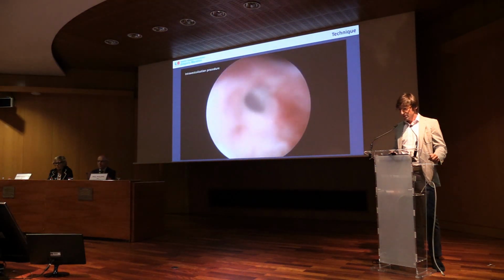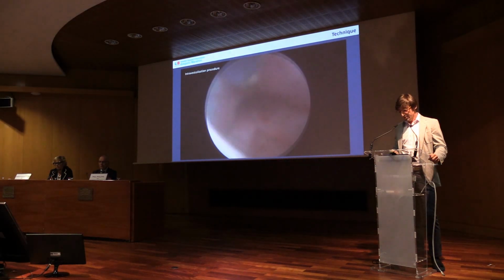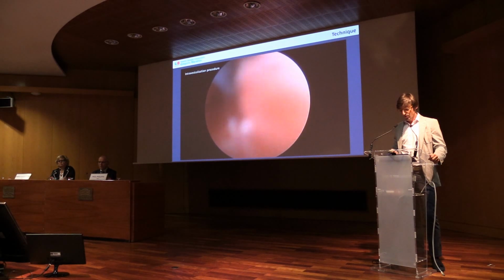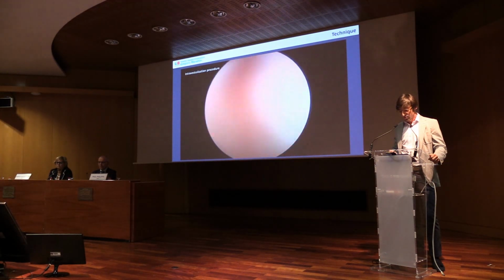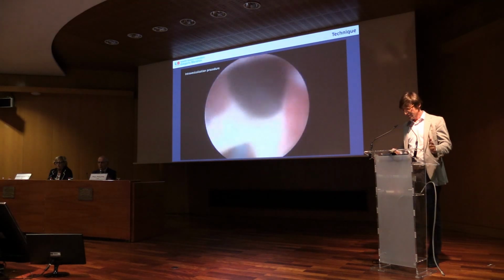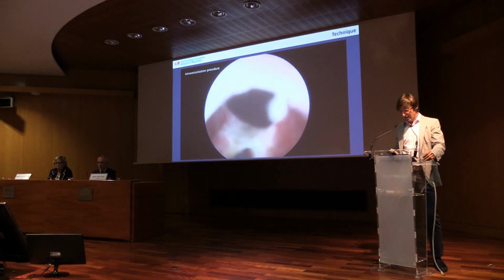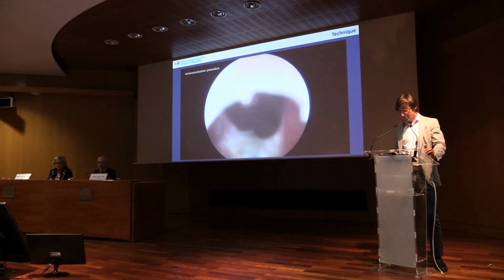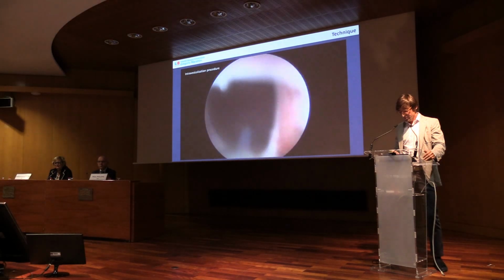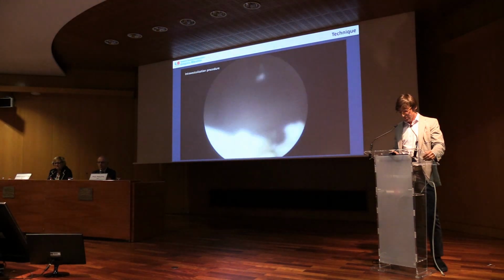On the other hand, if the ectopic meatus is found in the posterior urethra, we perform a ureteral opening with monopolar electrocautery to create a new ureteral opening into the bladder. This intravesicalization procedure is a routine for this ureteral ectopia, and this new ureteral outlet should be at the bladder neck or above to ensure continence in the future, but away from the trigone to avoid injuring the lower pole, the ipsilateral ureter, or the contralateral ureter.